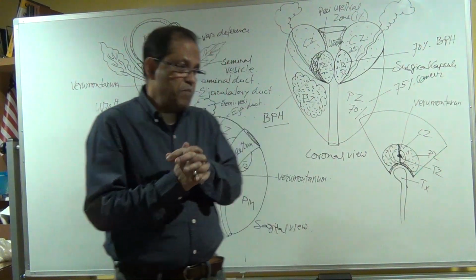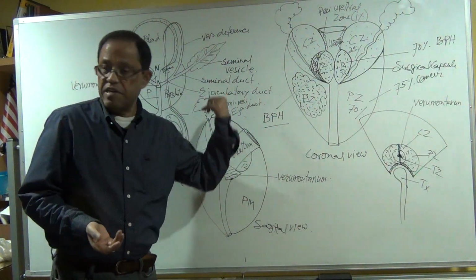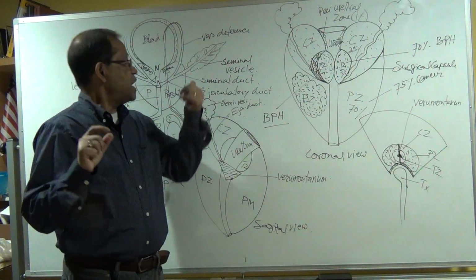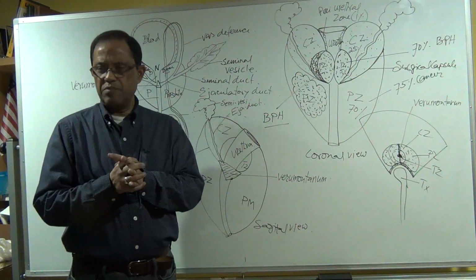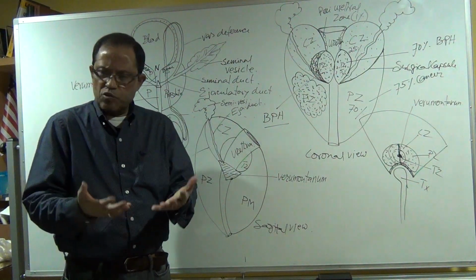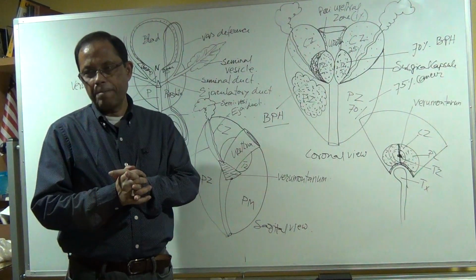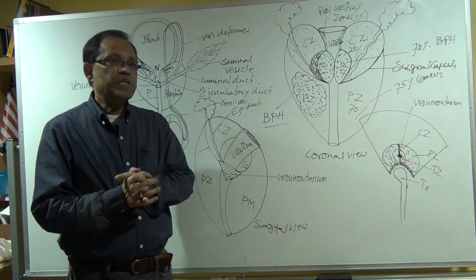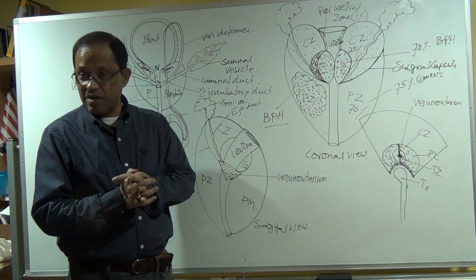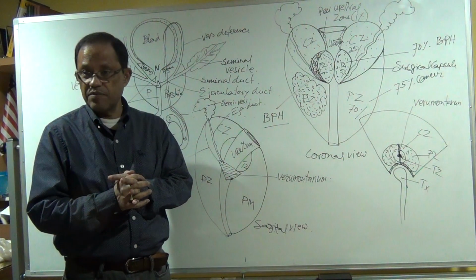Okay? The patient may come with cystitis along with the prostate enlargement and retention of urine. You will see the bladder wall is so thick because it's contracting, exerting too much pressure to release the urine, but it's not coming out. The patient will have a sleepless night. In the daytime, drowsy. Why are you falling asleep in the daytime?